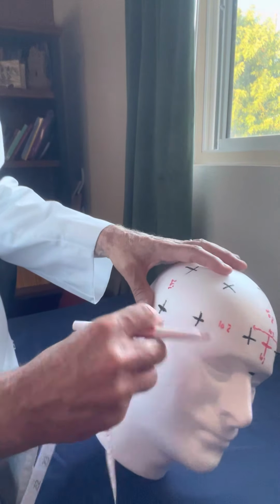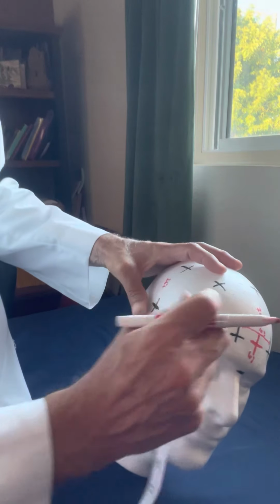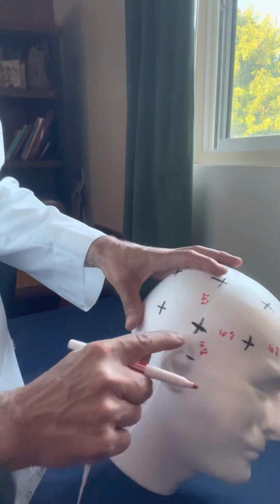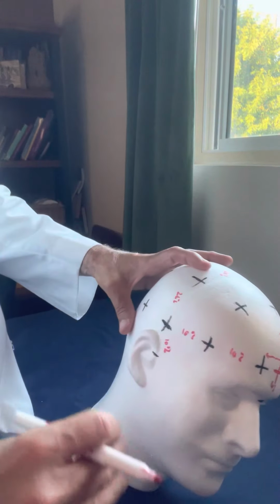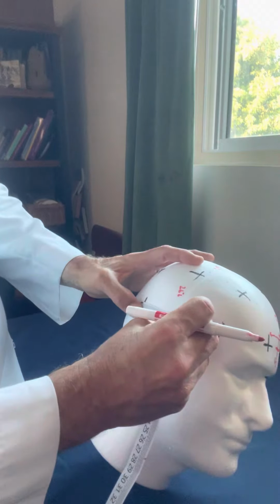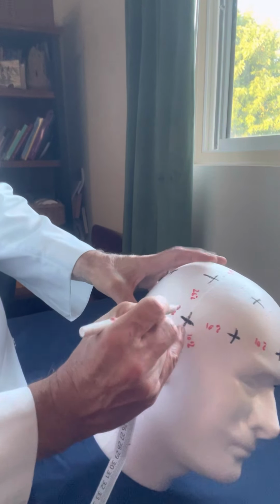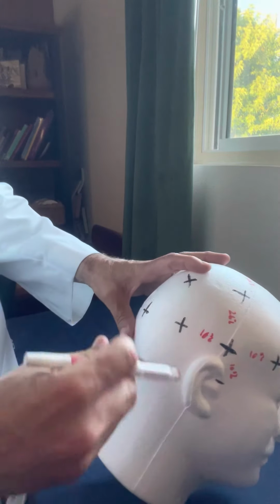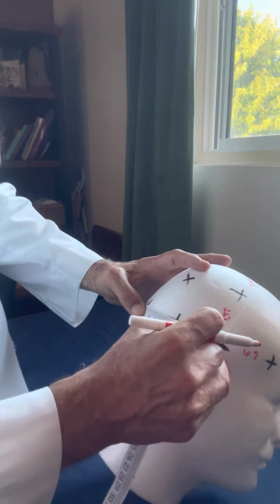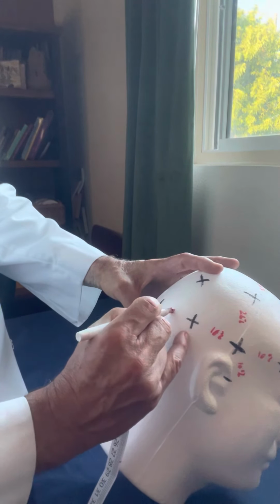From F8 to T4, it should be 5.5, and it's exactly 5.5, or 10%. From T4 to T6, it should be about 10%. It's about 5.4 centimeters. And from T6 to O2, it should be 5.5, and it's about 5.6, or 10%.